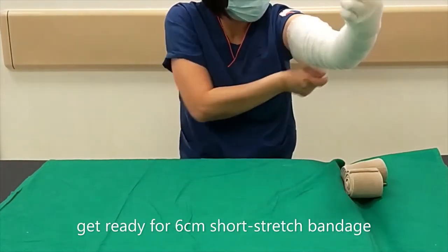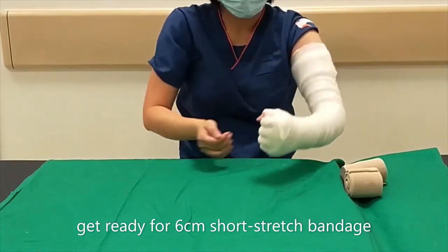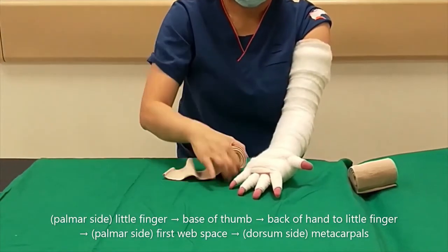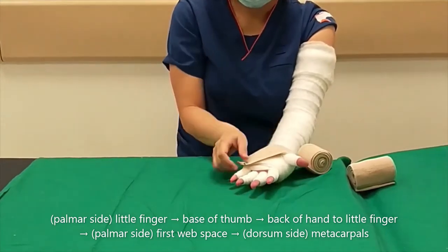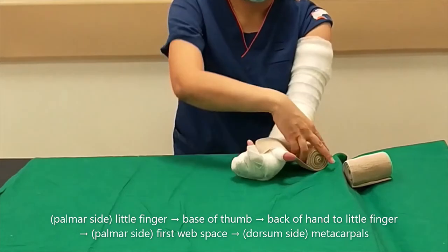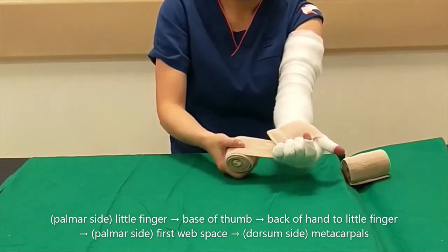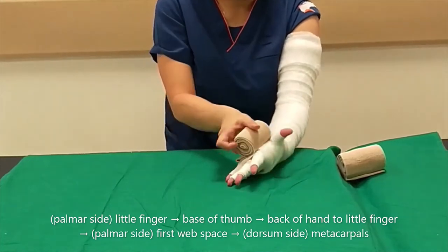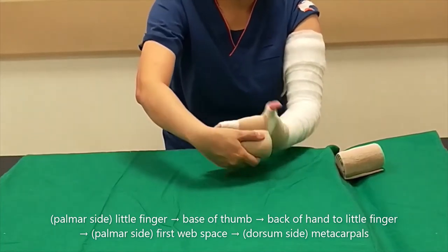Take a 6cm width short stretch bandage for the hand. Place it on the little finger side of the palm and cross over to the base of the thumb. Continue over the back of the hand to the little finger, covering the space between the first web space, then over the dorsum side of the hand over the metacarpals.